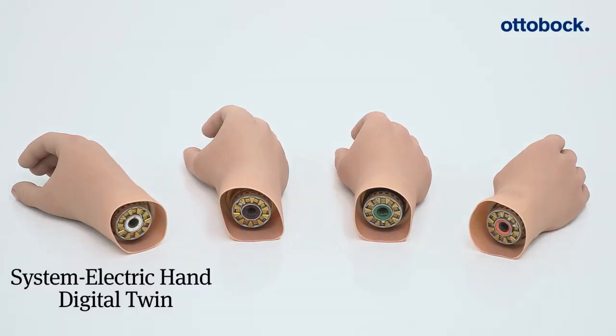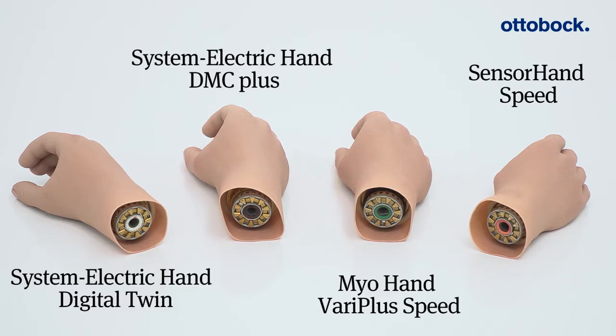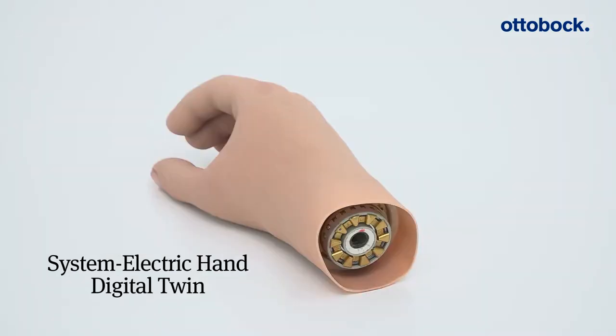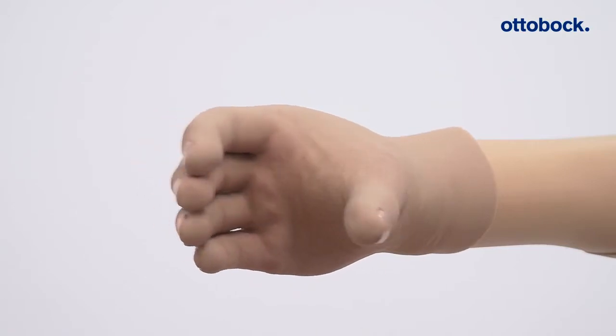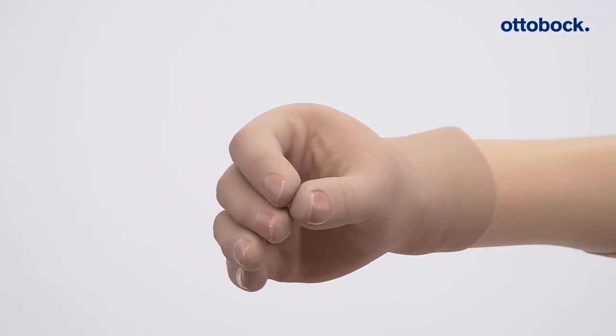The reliable Myo Bock system contains four different types of system electric hands which combine high functionality with natural appearance. The Digital Twin hand is a robust starter model for fitting with myoelectric hand prosthesis. It opens and closes with a constant speed of 110 millimeters per second.